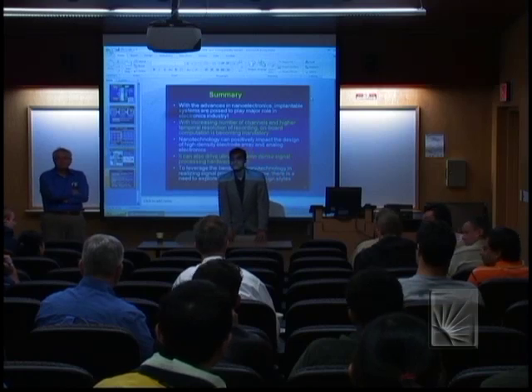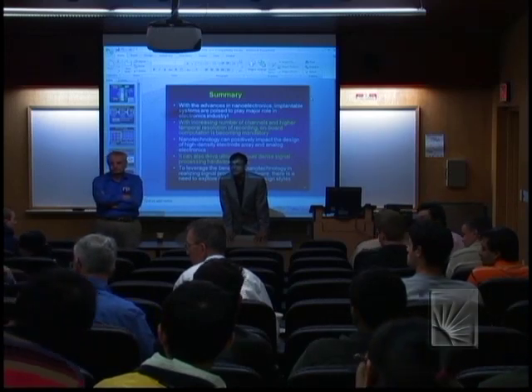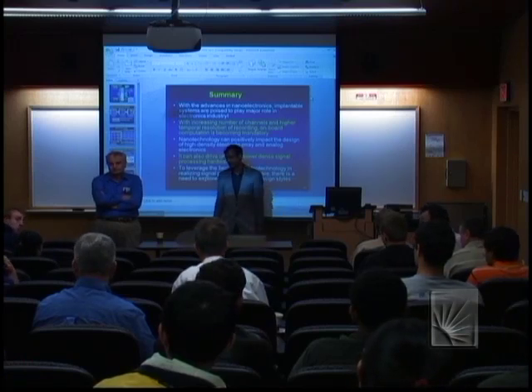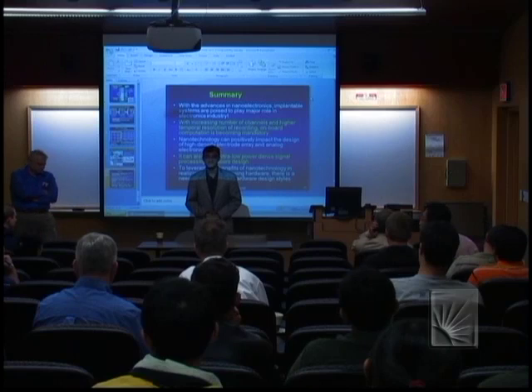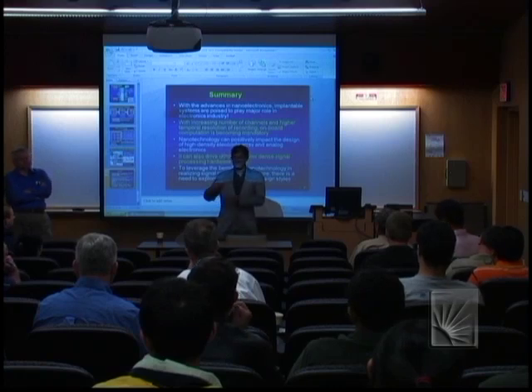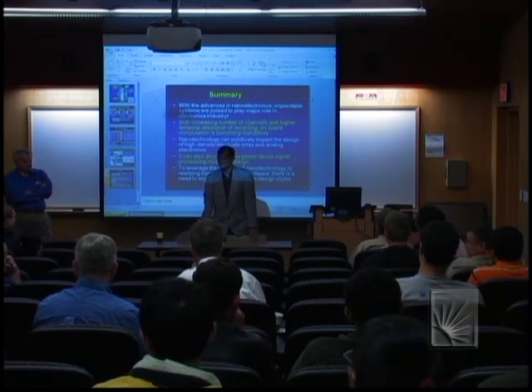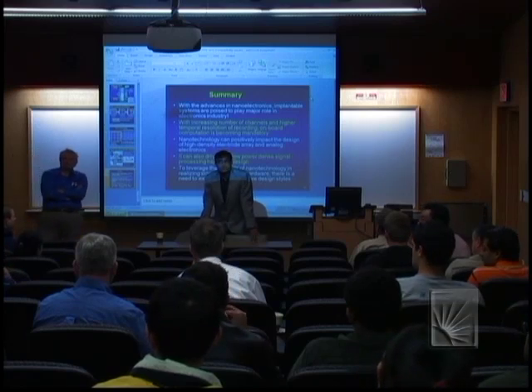Another question? I have a couple of questions. One is about the vocabulary-based neural interfaces. Is there any problem with variations between organisms for those vocabularies? Very good point. The vocabulary-based analysis actually depends on supervised learning. So to start with, you have to learn what the spike shapes are for this particular organism or for this particular nerve cell. Once that learning is over, you have a built-in vocabulary, and then you can encode your recorded signal using that vocabulary.